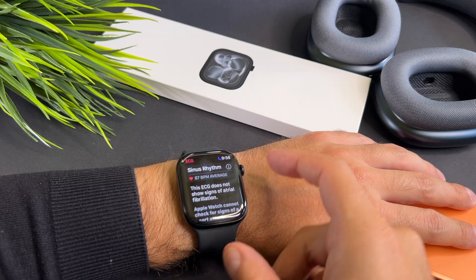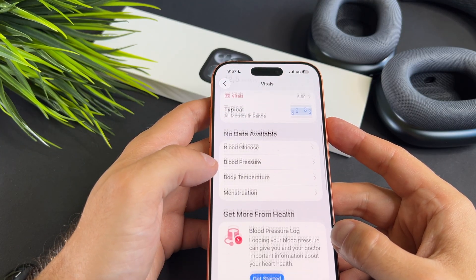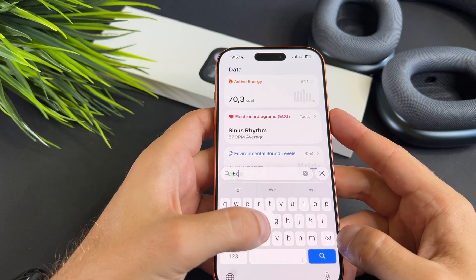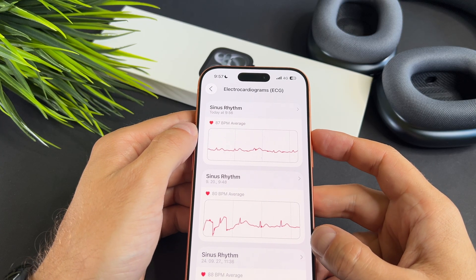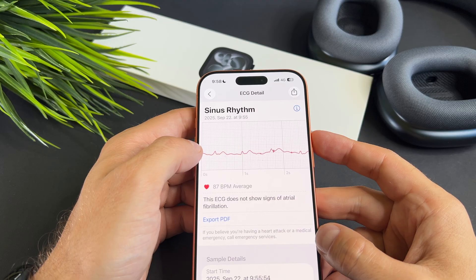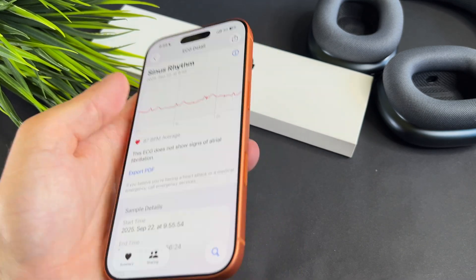As you can see, everything is fine with me. If you want to check the data or send it to your doctor, you need to open the Health app on your phone. This is my data, which I received a few seconds ago. I can export it as a PDF and send it to my doctor.